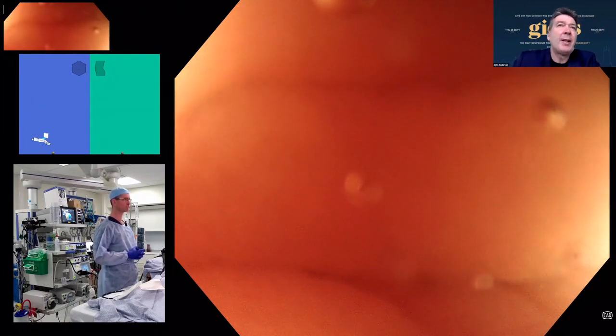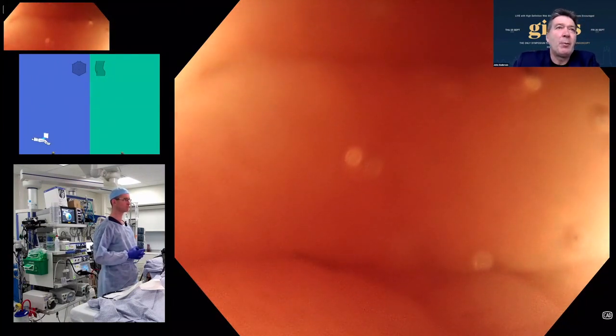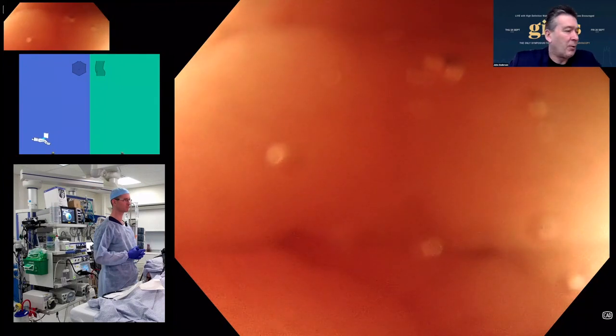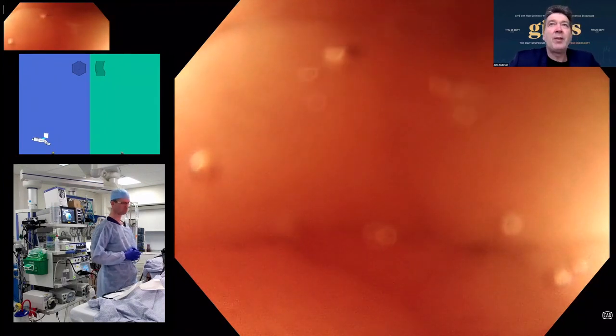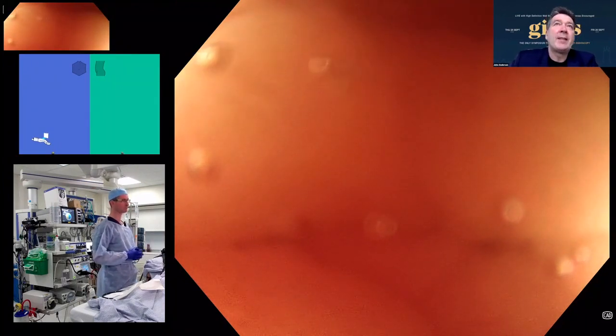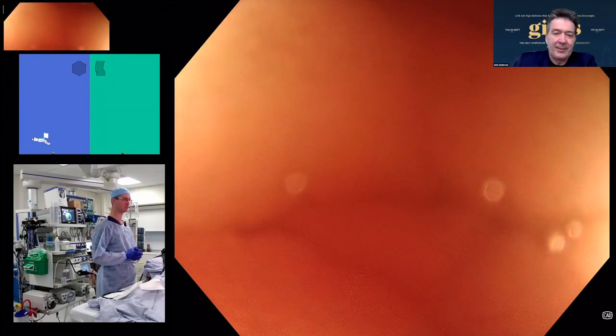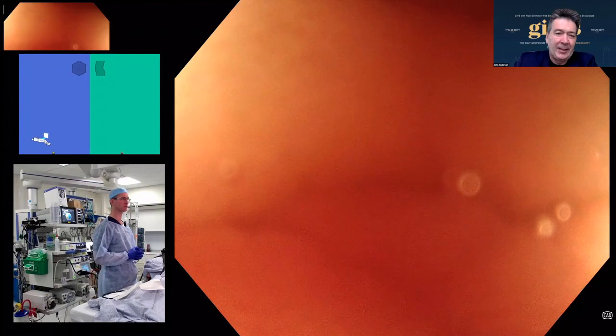But an interesting starting point is your selection of your colonoscope. Now, I appreciate some people may not have an option to select a colonoscope, but others do. So can you think of the factors that might influence your choice of colonoscope, and what have you chosen for today, or have you just been given one? I have been given one. It's an EZ-1500 colonoscope, CF.